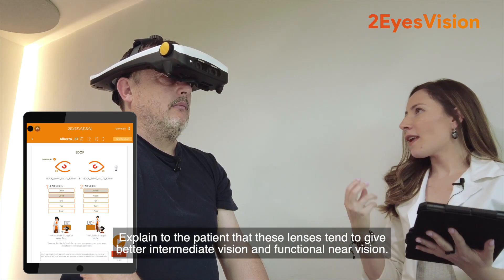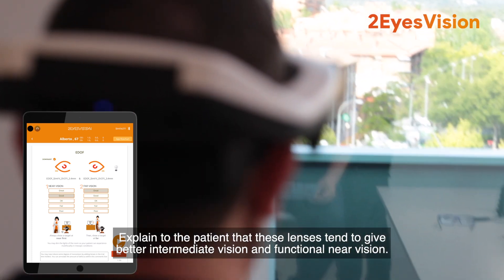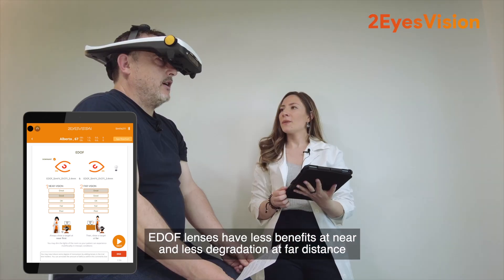Explain to the patient that these lenses tend to give better intermediate vision and functional near vision. EDOF lenses have less benefit at near and less degradation at far distance.